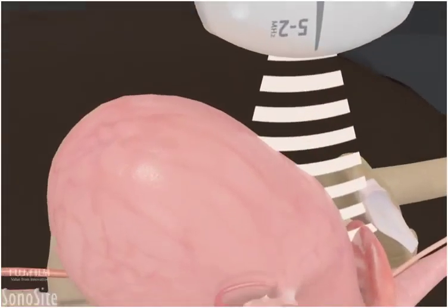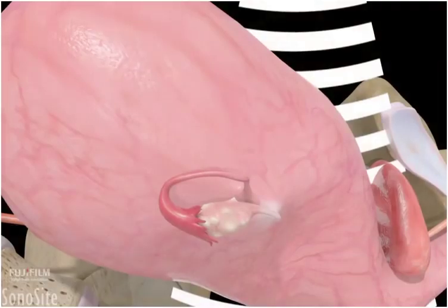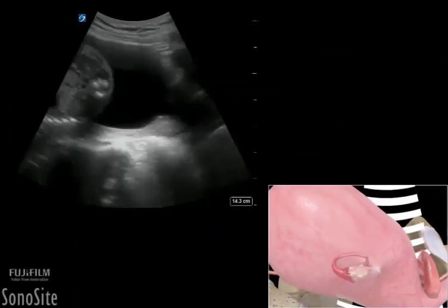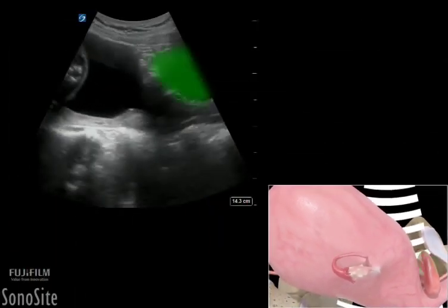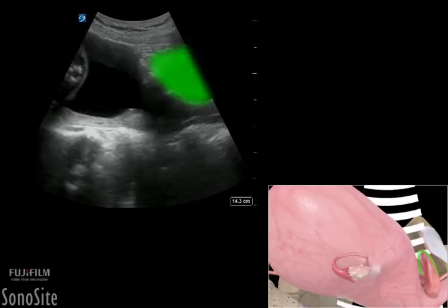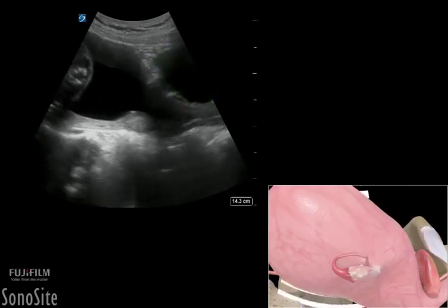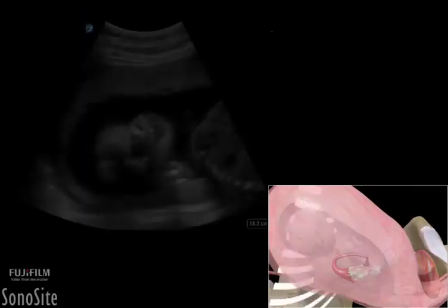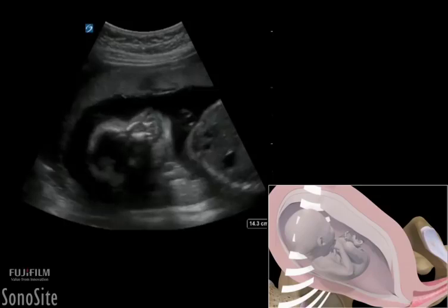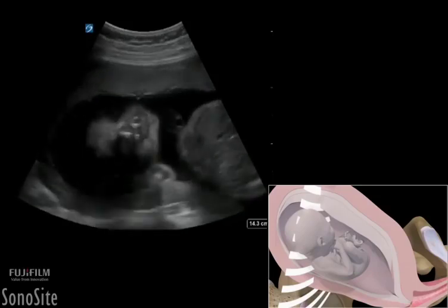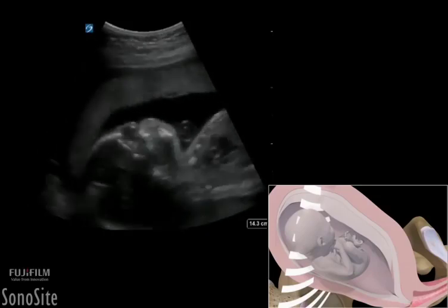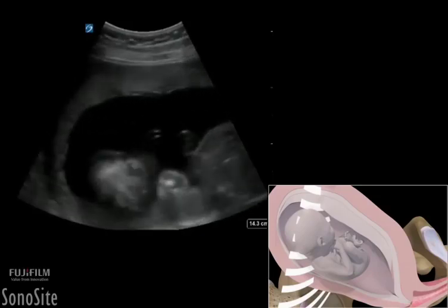The transducer is angled below the pubic symphysis into the pelvis to visualize the bladder, which appears as a hypoechoic triangular structure. The transducer is then rotated to a transverse orientation with the orientation marker directed to the patient's right.